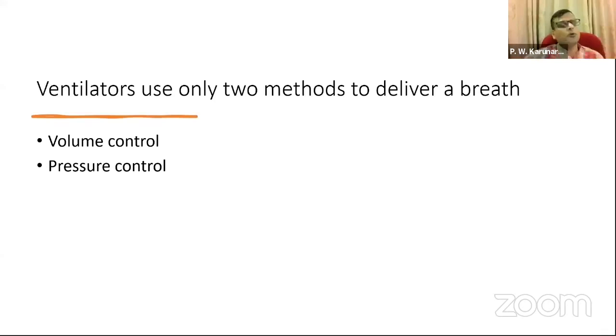So remember that all the complex ventilator modes are using either one of these, either volume control or pressure control kind of method. There are only two ways of delivering a breath, either volume or pressure. So that is the ultimate basics about the methods of delivering a breath.